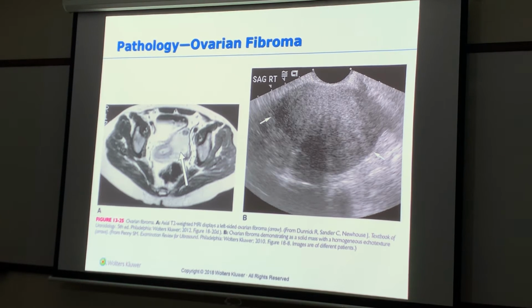Okay? Because it doesn't cost us anything to take that extra image. And we want him or her to know exactly what we're doing. Now, if I'm superior, inferior, I'm not gonna do that. I'm gonna start superior and I'm gonna go inferior. But if I'm sagittal, I have to take that midline shot again. Does that make sense?